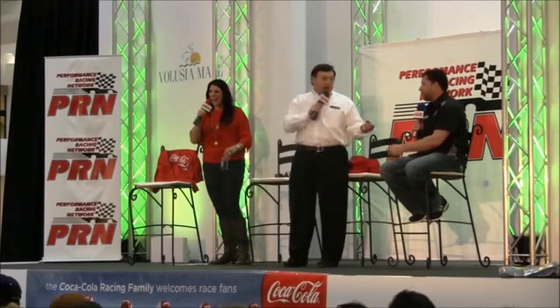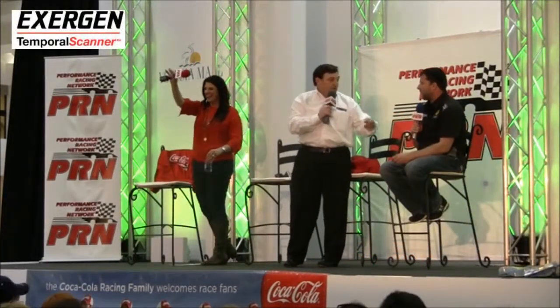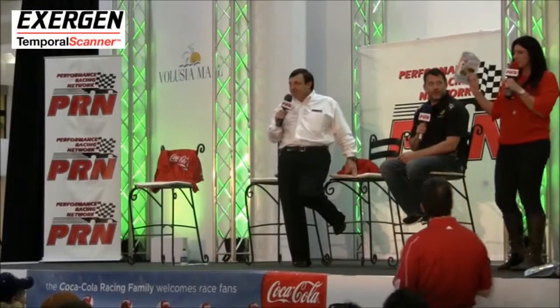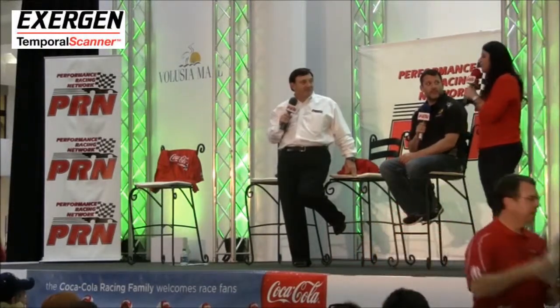I'm going to let you give away one of our Exergen thermometers. You can put it on your foreheads, ears, or rears to take your temperature. Explaining to you guys the Exergen thermometer — you scan it across your forehead. It's helpful if you were to have children.